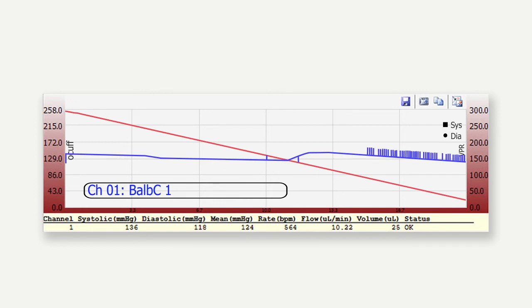As the occlusion cuff deflates, blood will flow back through the tail across the VPR cuff, which is represented by an upward curve in the blue line on the graph. Heart rate pulses are notated by short vertical lines and are measured towards the end of the cycle. Systolic and diastolic measurements are noted at the bottom of the graph.